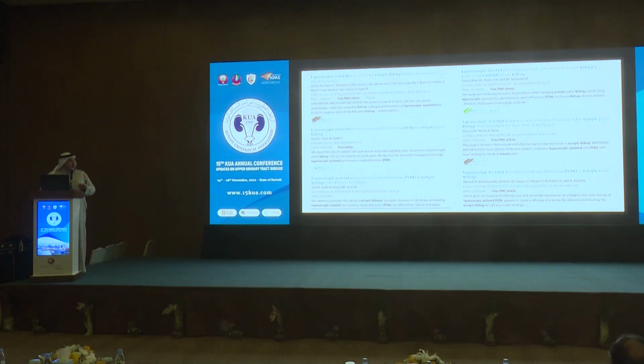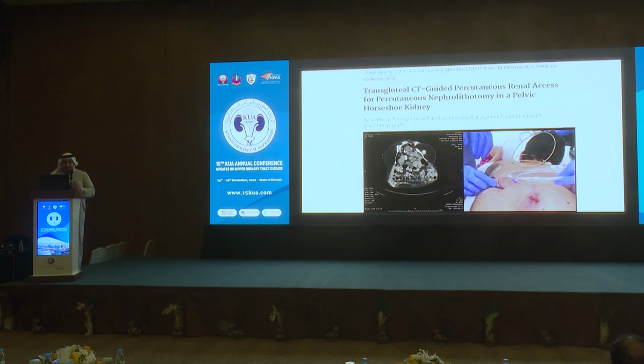A lot of reports are describing the laparoscopic-assisted PCNL. Most of them are case reports because of the rarity of this disease. And because of the rarity of the disease, sometimes you have to do a personalized approach. For example, this is a procedure describing a transgluteal approach for a horseshoe kidney in the pelvis.